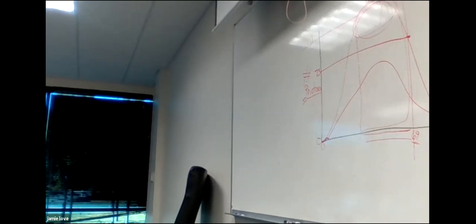Look at page 70, the chart that says change in milliamps. So we have a green line and a pink line. Again, I'm thinking pink. 200 mA, 400 mA.